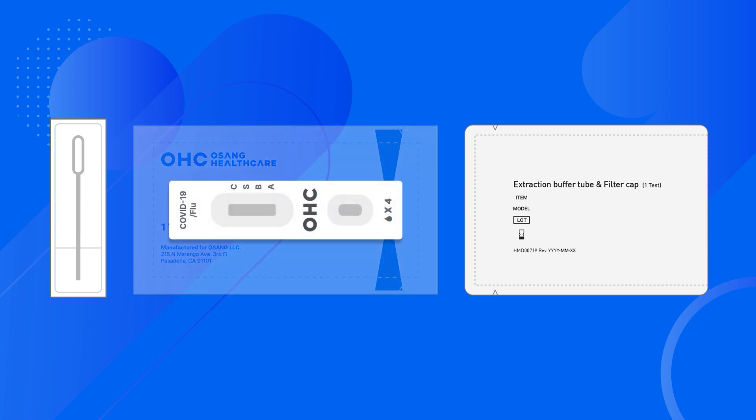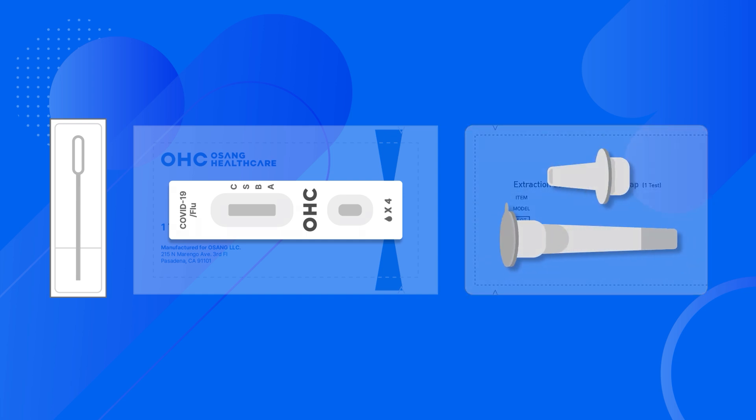The swab is in a narrow paper and plastic peel pouch. One pouch contains a test cassette — a rectangular white and blue pouch with text labeling OHC Osang Healthcare — a long flat white rectangle. The other pouch includes a filter cap and a buffer tube: a shorter rectangular white pouch labeled extraction buffer tube and filter cap, showing the filter cap with a narrow nozzle and a cylindrical tube with a flat foil seal on top.